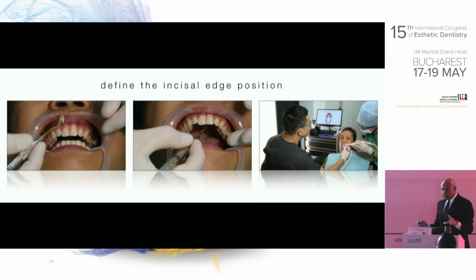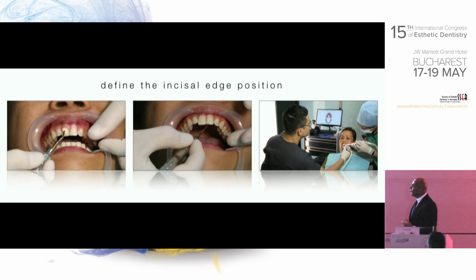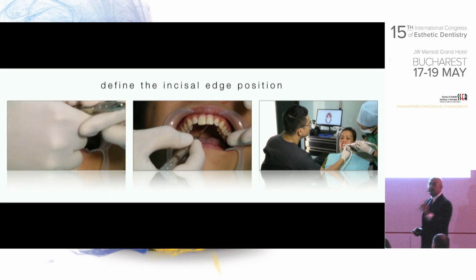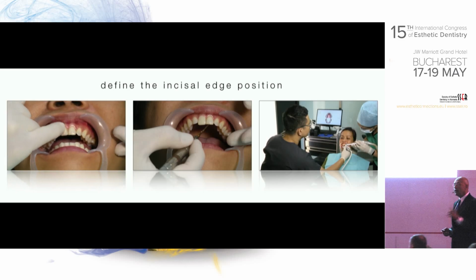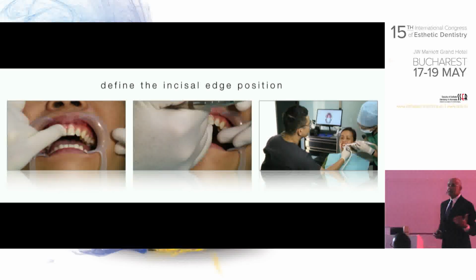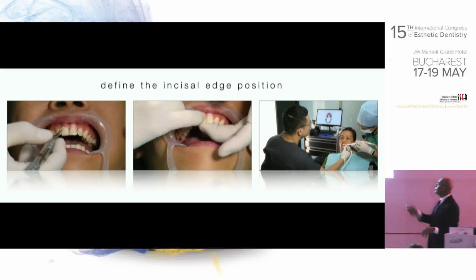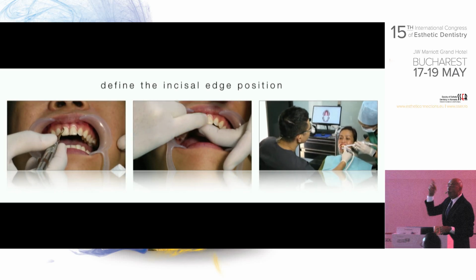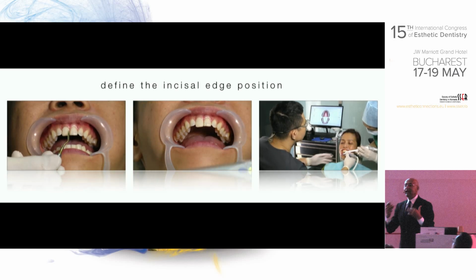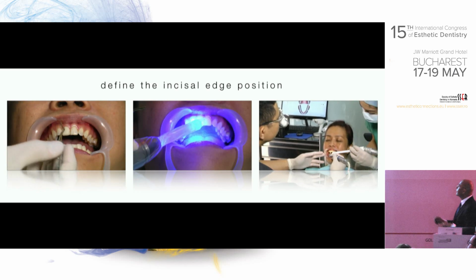So with this now, Bruce Lee, who is the dentist, or the owner of this clinic, this is how he starts. He is placing a single mock-up on the central, sort of correcting it, even though I was telling him, don't go for perfection. He's a perfectionist. He wanted to do the best he can. Always sit the patient upright, face to face, decide on the incisal level. This is very, very critical.